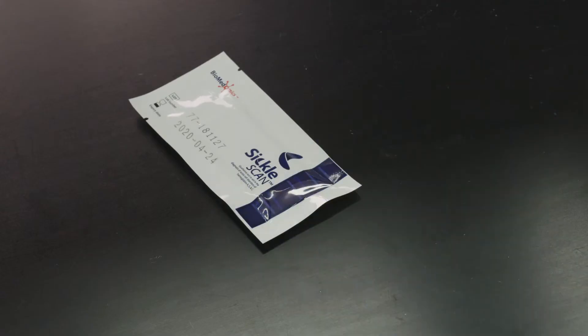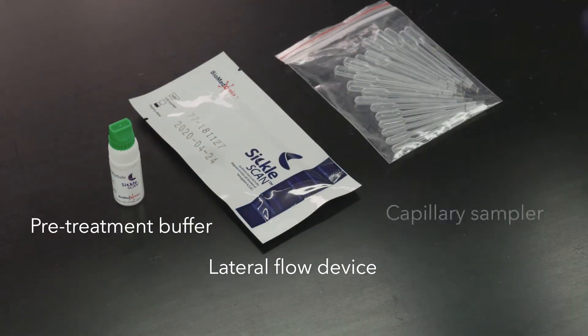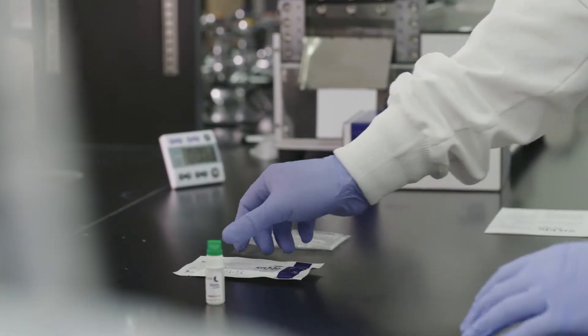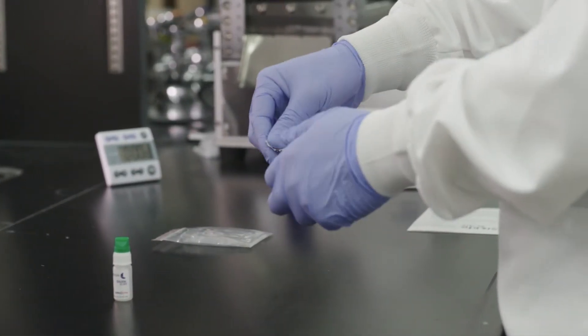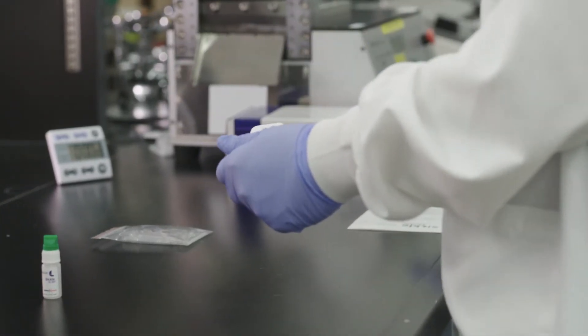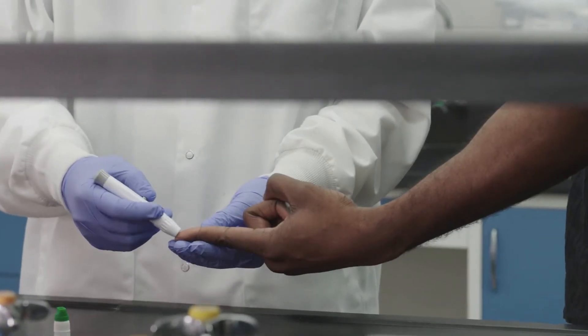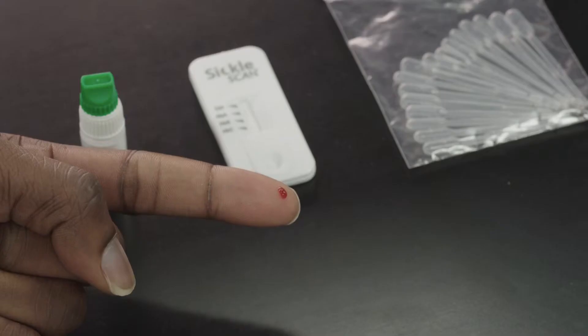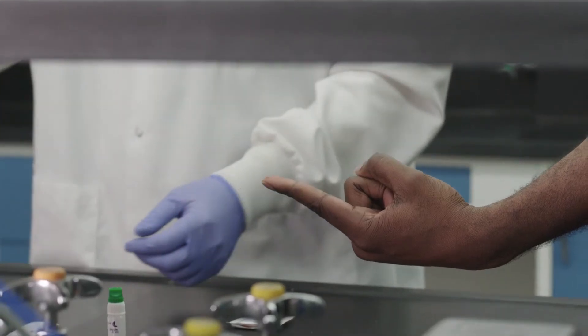The SickleScan kit includes a lateral flow device, a pre-treatment buffer, and a capillary sampler. To use, first remove the SickleScan device from its packaging and place it on a flat surface facing the user. Pink lines appearing on the test strip are normal and part of the factory quality control procedures. Acquire a finger prick, heel stick, or venipuncture sample. Lightly touch the capillary sampler to the patient's blood, filling it to the black indicator line.